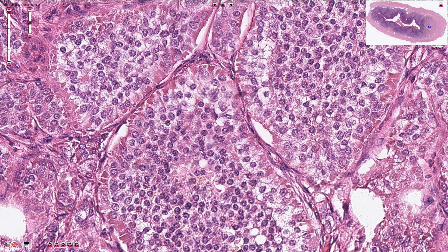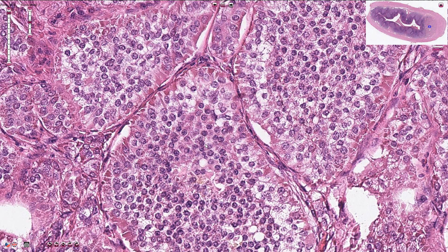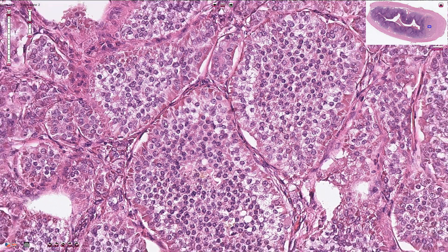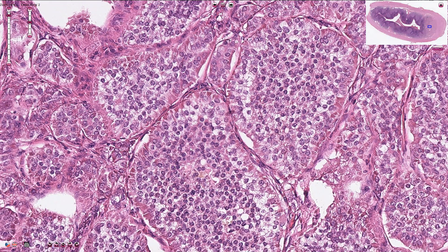Neuroendocrine tumors usually don't have a prominent nucleolus, so we can see just small nucleoli here and there. We shouldn't see a huge or large nucleolus.